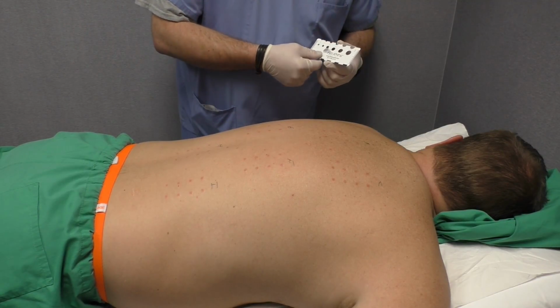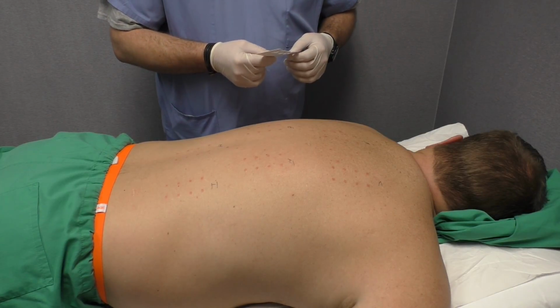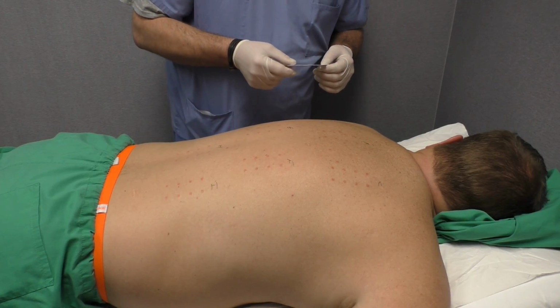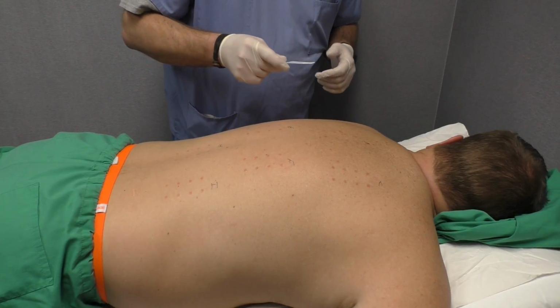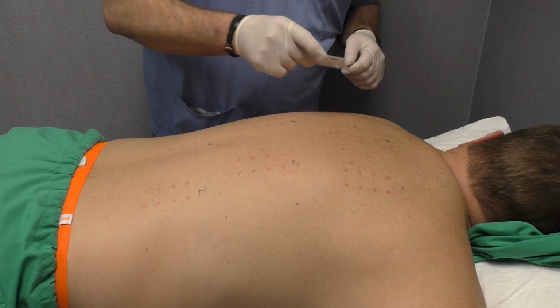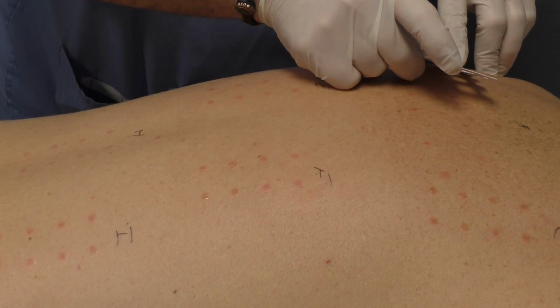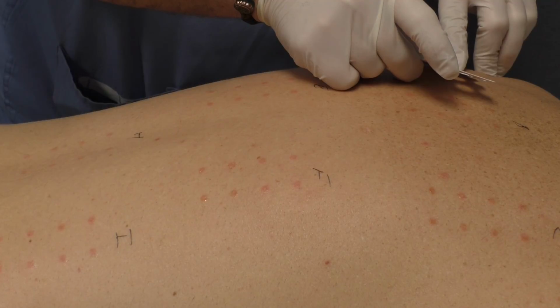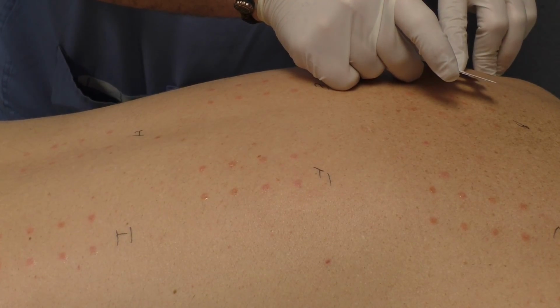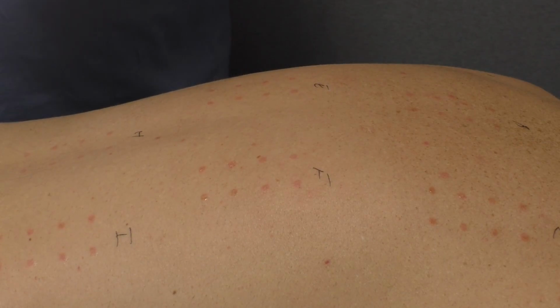Your histamine control is found in the A1 coordinate. You should almost always see a reaction here unless the patient was taking a medication they shouldn't take prior to testing. The typical measurement for the histamine control will be between 4 and 7 millimeters. And as we can see here, we have a 5 millimeter histamine control. This would then be marked on the patient evaluation form.